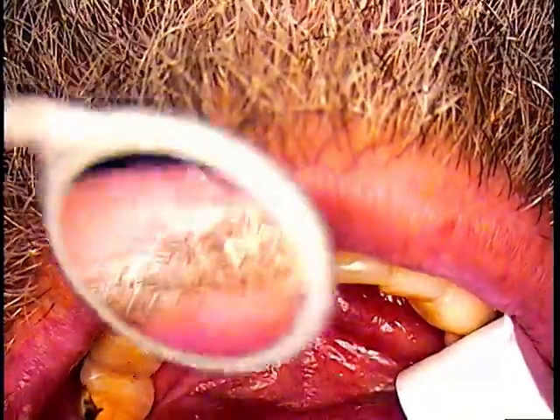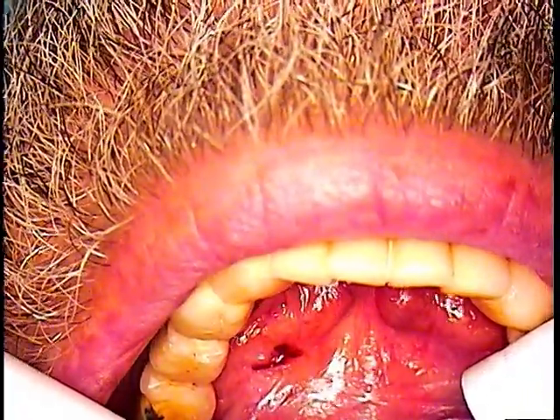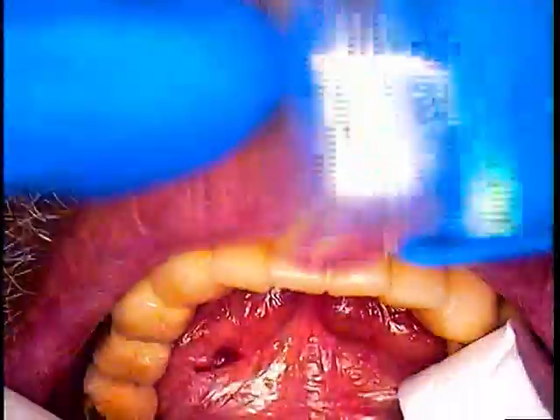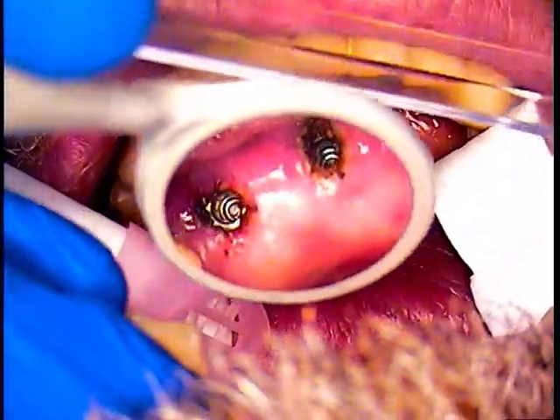All right, so my dental assistant is going to turn her high-speed suction on. She's just going to kind of hang out. And we have a container for these. We always like to put them all in a nice container. This is a good lab, ADT, Advanced Dental Technologies, out of the Boston area. We do a lot of work with them, so I thought I'd give them a shout out.